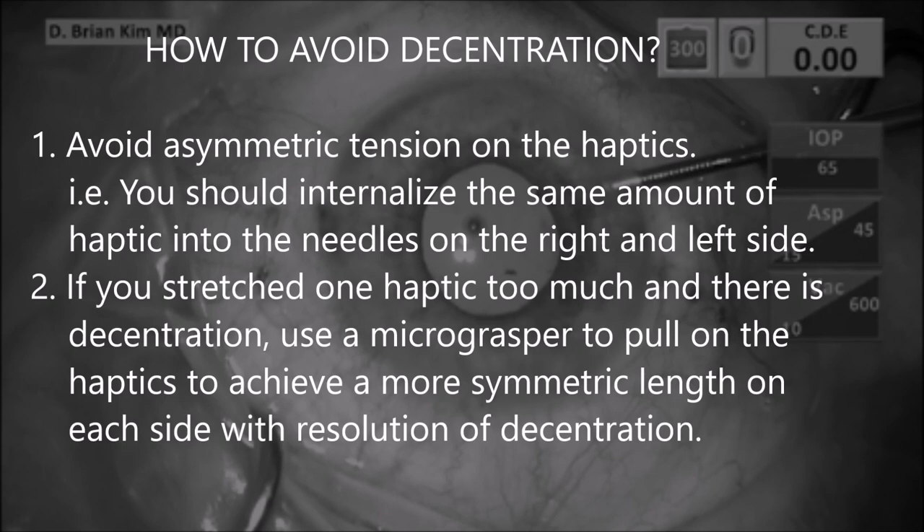But if this happens and you have decentration — if you've stretched one haptic too much — use a micro grasper to pull on the haptics to achieve a more symmetric length on each side, with resolution of decentration.